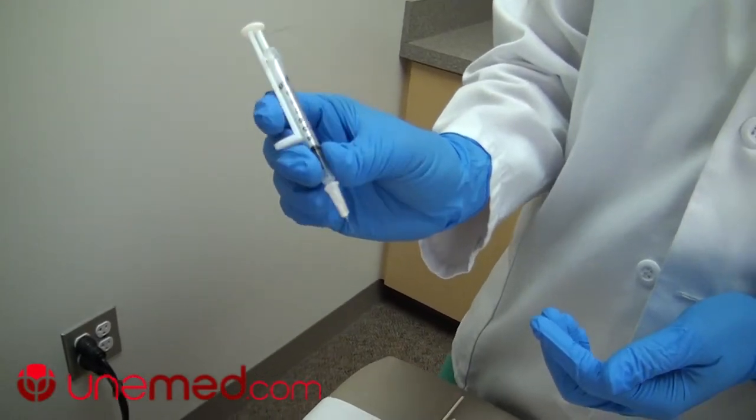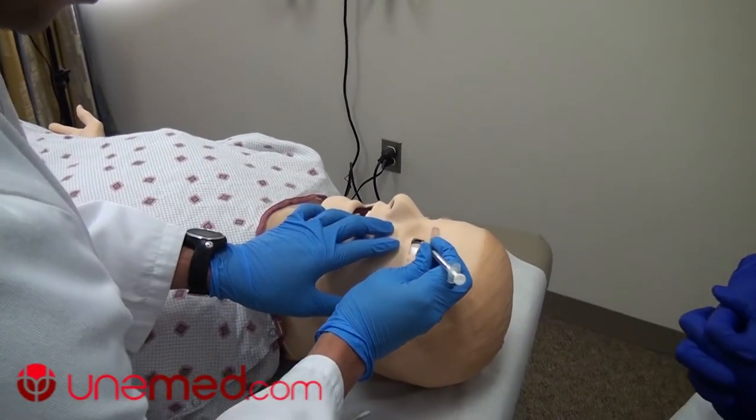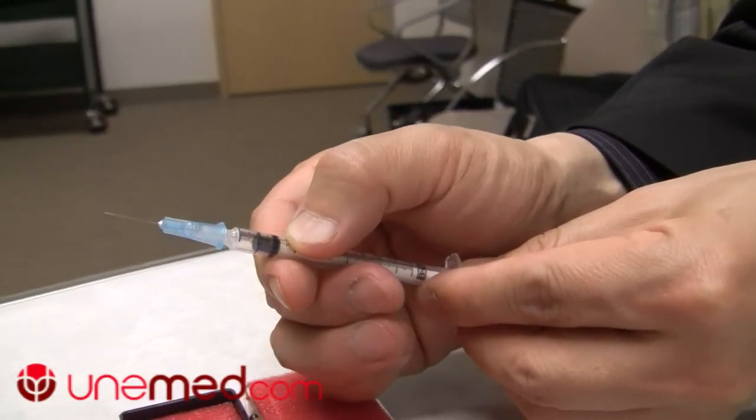This is a syringe — a very simple design that makes what we do much safer. My profession is pediatric eye surgery and I do surgeries on babies and pediatric patients. Whenever I'm actually injecting any medications into the eye, we are typically injecting a very extremely small amount.